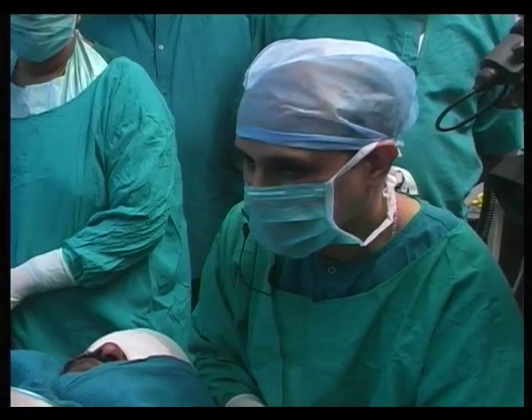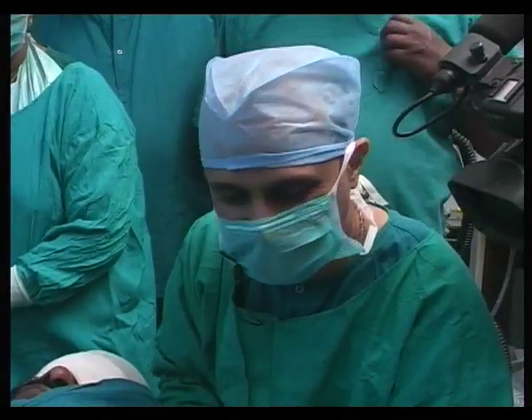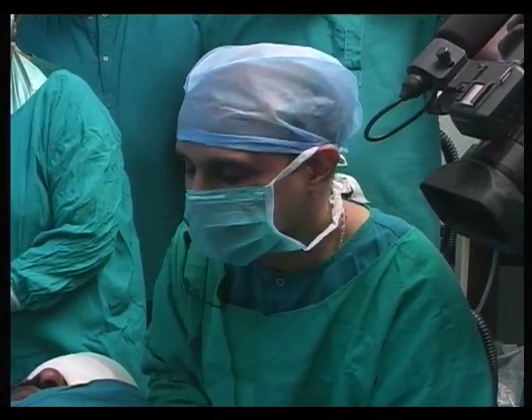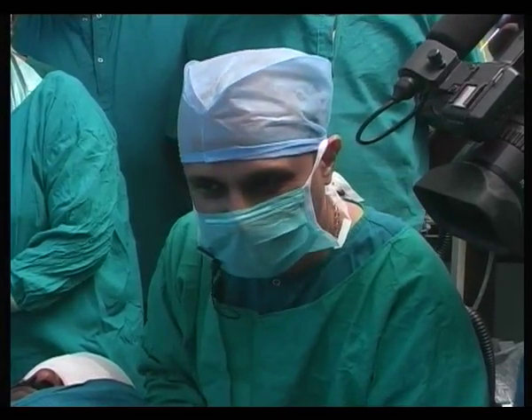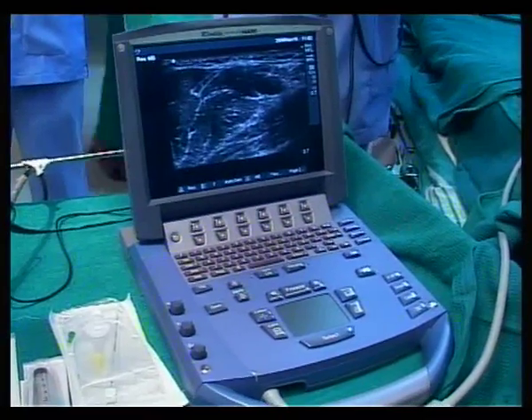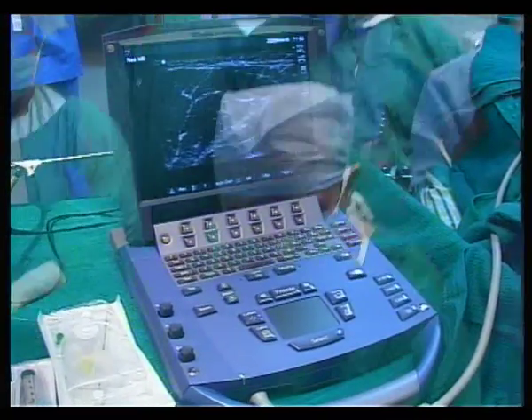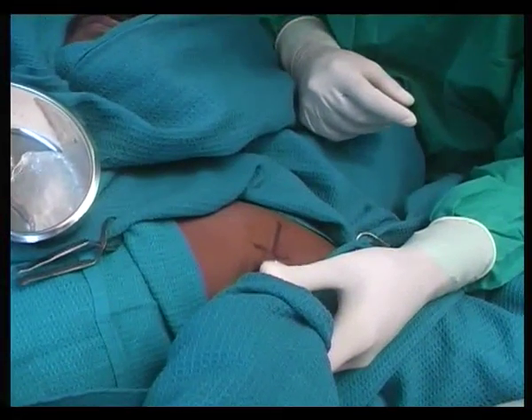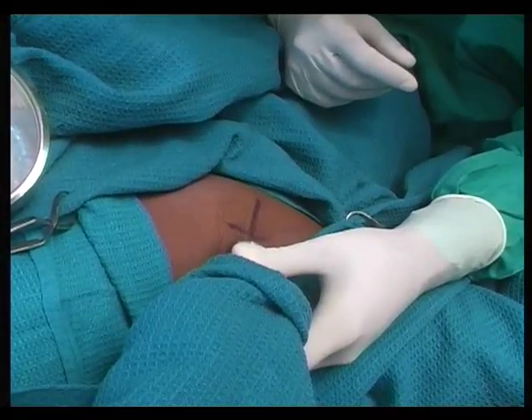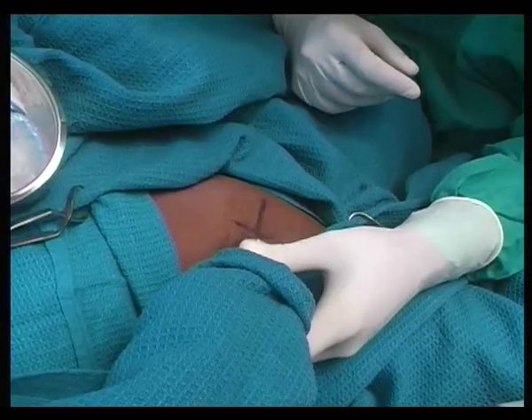Before you start any block or procedure, you need to know what machine you are going to use, what patient position you are going to opt for, and what type of nerve block you are going to give the patient. This patient has cellulitis of the wrist and we have chosen the axillary approach to brachial plexus block.